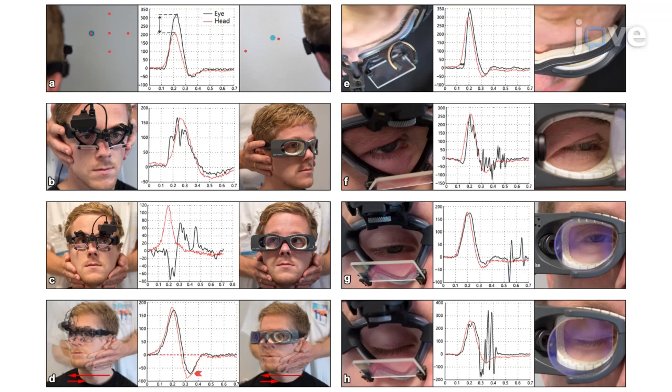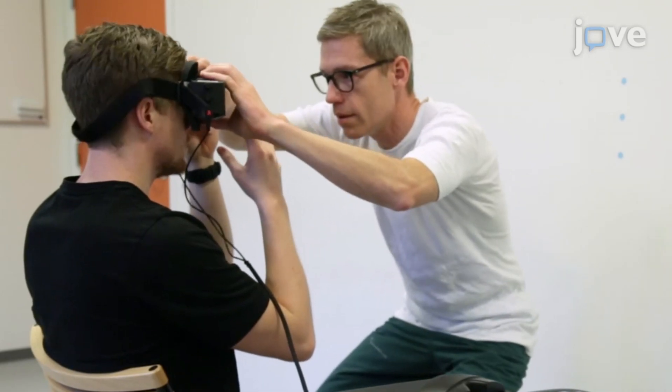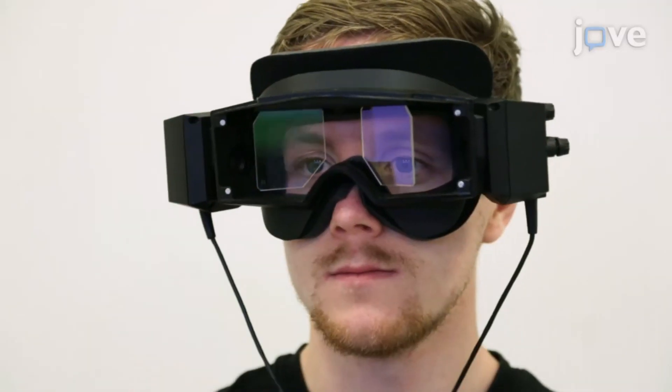For a complete examination of all 10 vestibular organs, vestibular evoked myogenic potentials may be added upon completion of VHIT testing. Head impulses need to be fast, abrupt, unpredictable, with high acceleration and with low amplitude. Potential pitfalls must be accounted for. This protocol provides a better understanding and a more precise diagnosis of inner ear diseases, facilitating targeted treatment options. Do not perform this test if the participant experiences any neck problems.